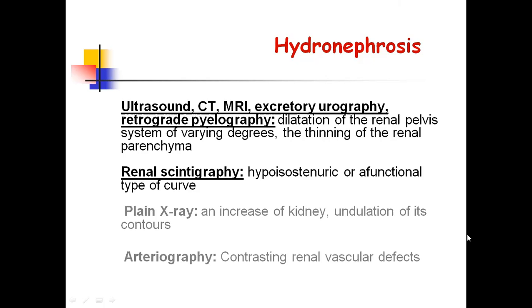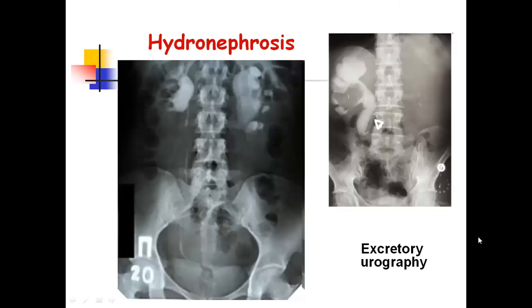And methods of examination which are printed in light gray colors are additional. You may read what they allow to distinguish, but their validity is not very essential.